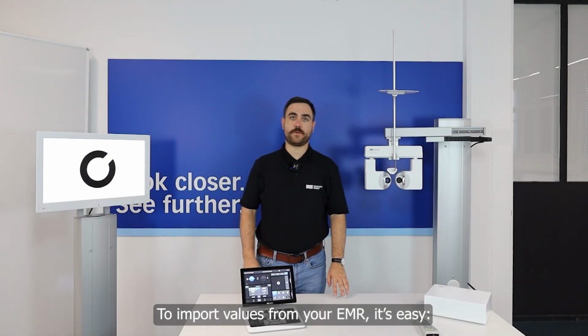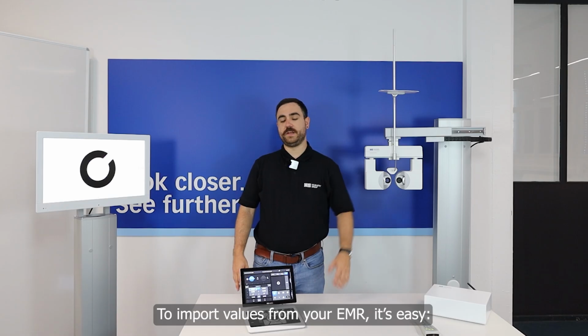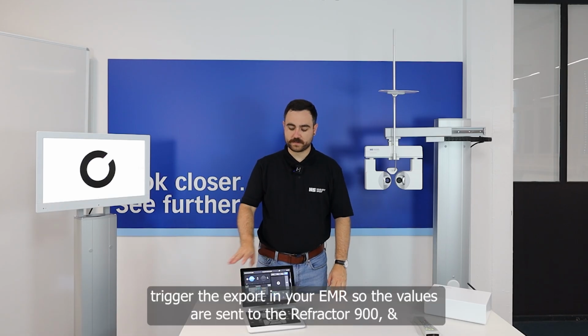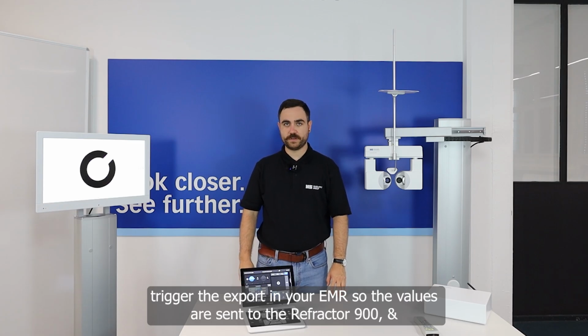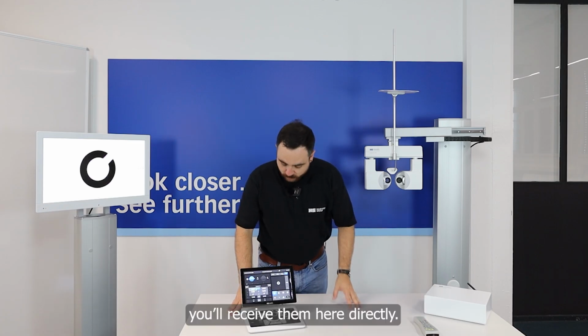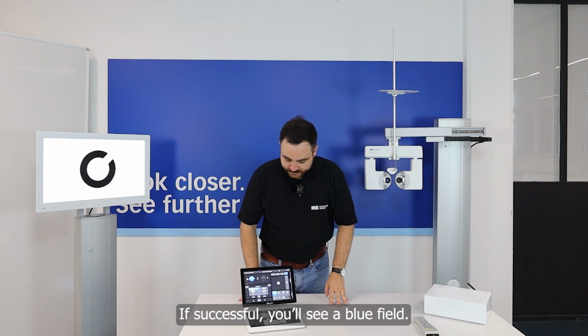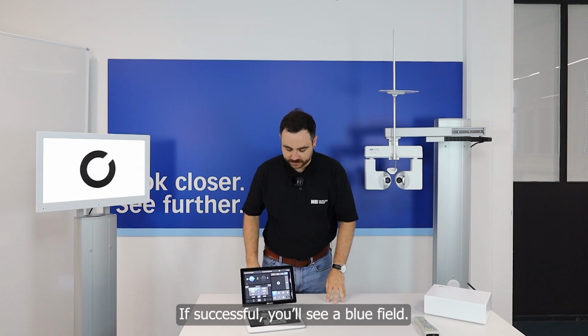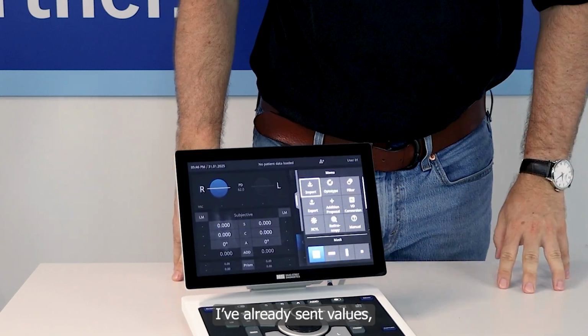To import values from your EMR system, it's really easy. Press at your EMR system that the values are sent to our Refractor 900, and then you will receive it directly in here. If it was successful, you will see it here in a blue field. I already sent the values in it.